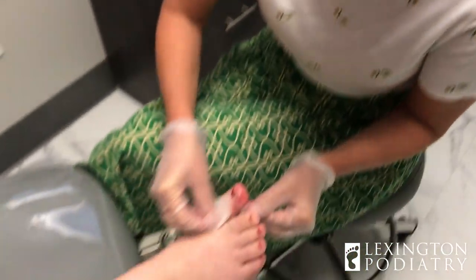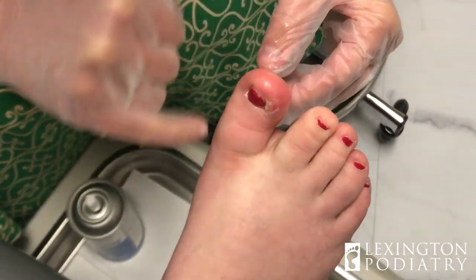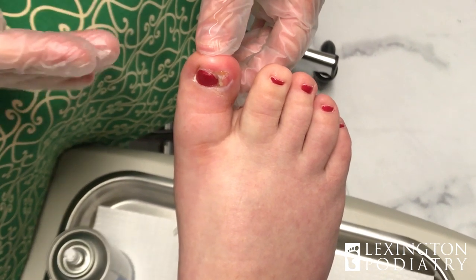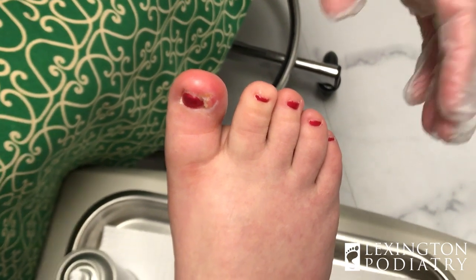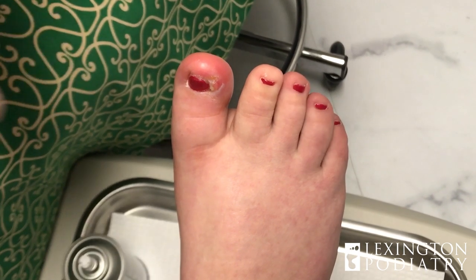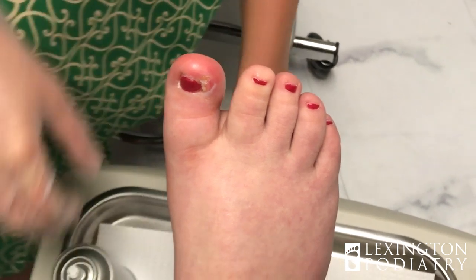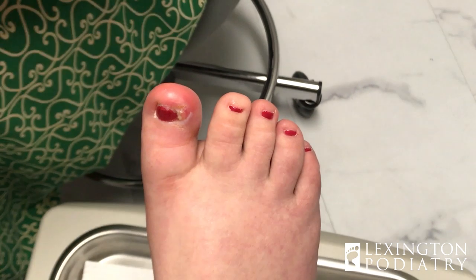First thing we're going to do is just clean up the area. You can see it's really swollen — the whole toe is swollen and it's gotten infected. I mentioned to her: make sure not to trim your toenails too short, because you're kind of asking for an ingrown toenail at that point. A lot of kids pick at it, and if you dig in there you're going to give yourself an ingrown. So don't do that. If you feel any pain right away, give us a call. Don't dig — that makes it worse.